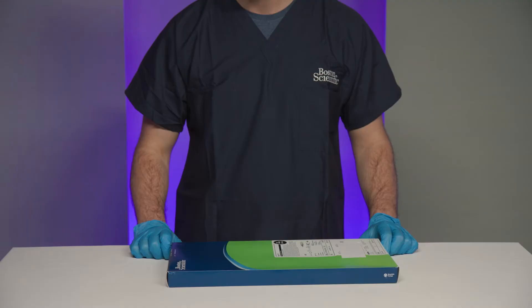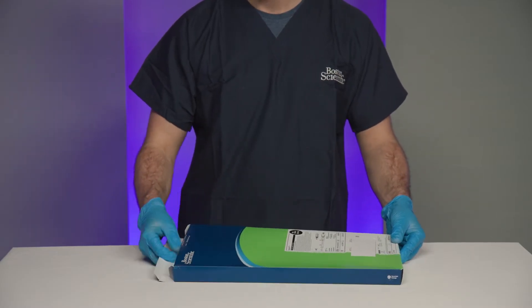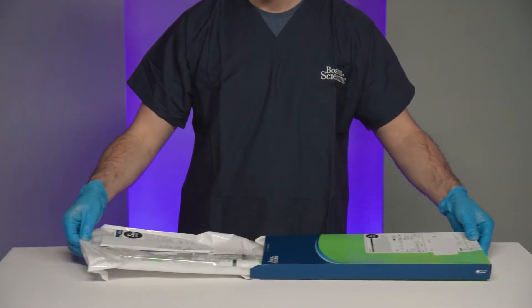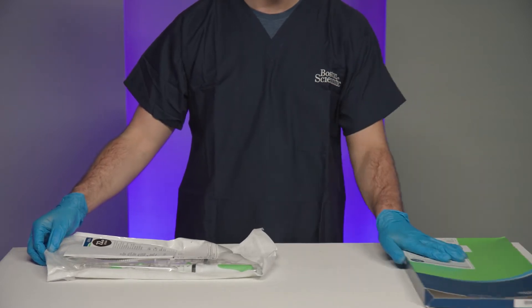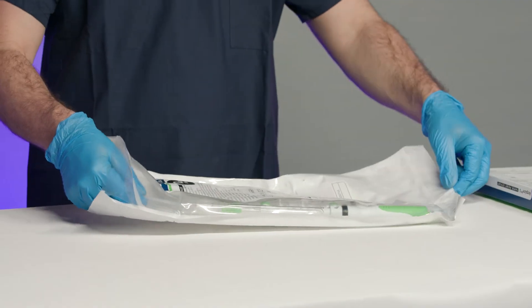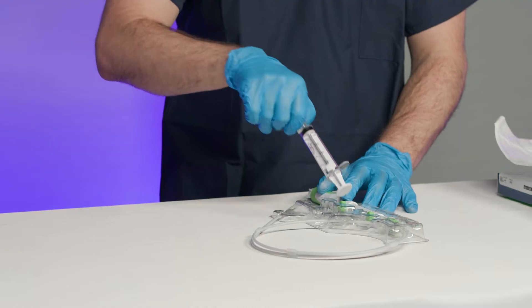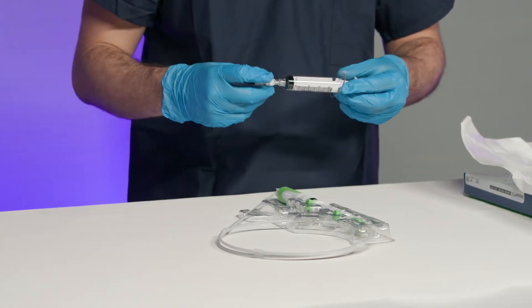To set up the product, choose the appropriate size of device for the procedure and inspect device labeling to ensure it is within acceptable shelf life constraints. Remove the device from the carton and open the device package. Remove the plastic insert containing the Acquire-S device and syringe, then remove the syringe from the package.